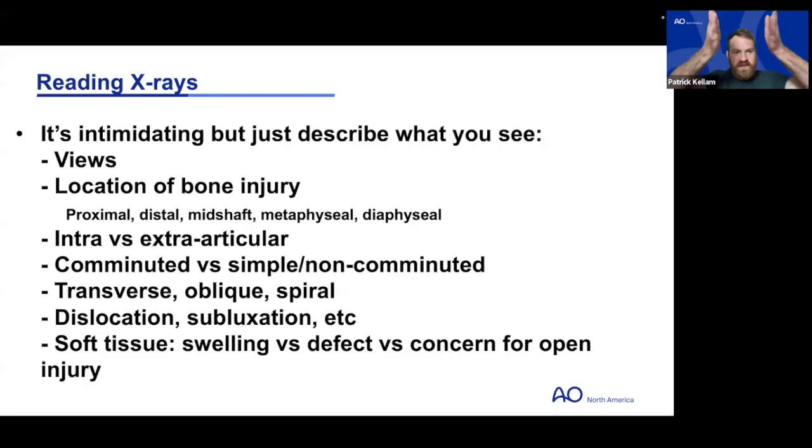The other thing I think that in the soft tissues is you can see tourniquets on extremities. The soft tissue shadow will kind of become an hourglass, and you can actually see the outline of a tourniquet, normal ones that the EMS folks use, which can clue you into certain things for the patient when you're trying to go down and evaluate them when you've just looked at an X-ray before you've seen them. So it's all just little clues for you to prepare yourself when you get down to the emergency department or in clinic or wherever you are.